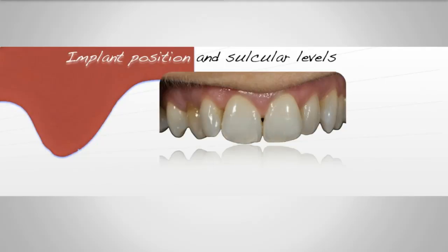Your implant position certainly affects your sulcular levels. So what I'm trying to do here, if this is the patient's ridge, this is the vestibular area, this is the palate. So if you're looking across there, if this happens to be this area where this canine is, if I put that implant, or have the implant placed right where the canine is, my soft tissue level is going to be about here, where it was previously.